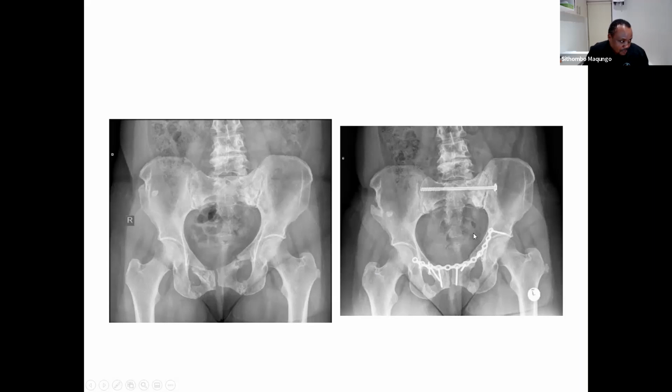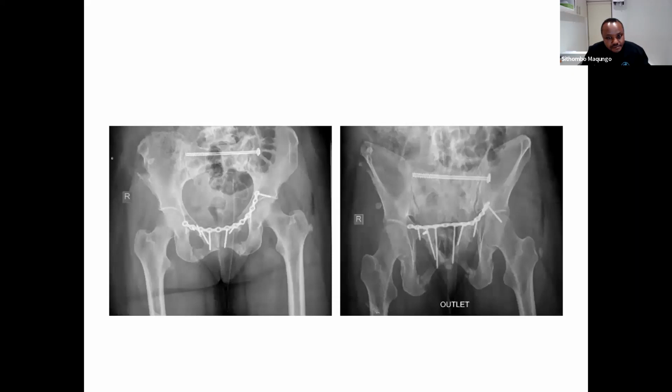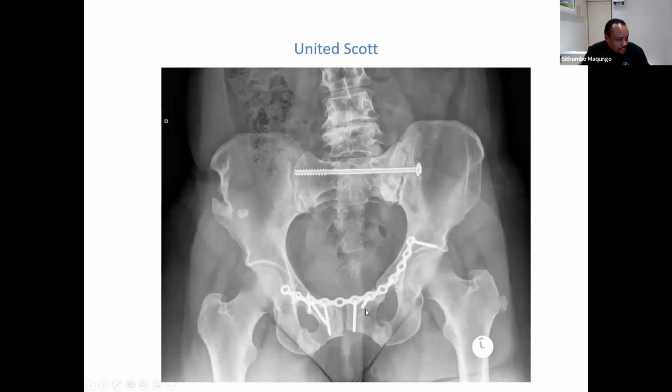And on the CT scan, in fact even on this picture, you can see there's a whole lot more activity going on if you look at the sclerosis on the left sacrum. So she needed anterior plating and she needed a left sacroiliac screw. And that's her post-op. And she then went on to unite. Now you can appreciate the union anteriorly, and a whole lot more sclerosis and density at the back. So she went on to unite.